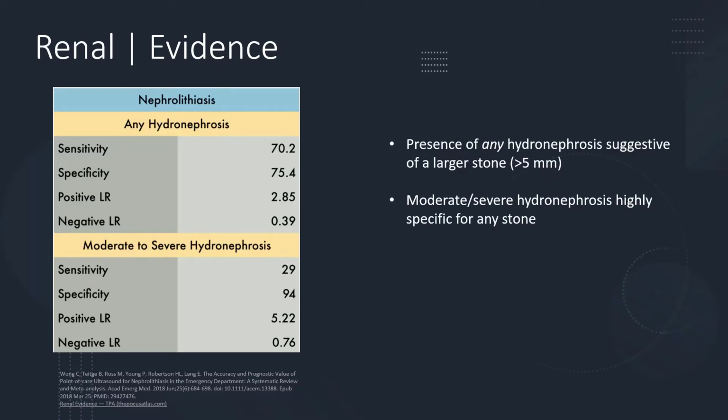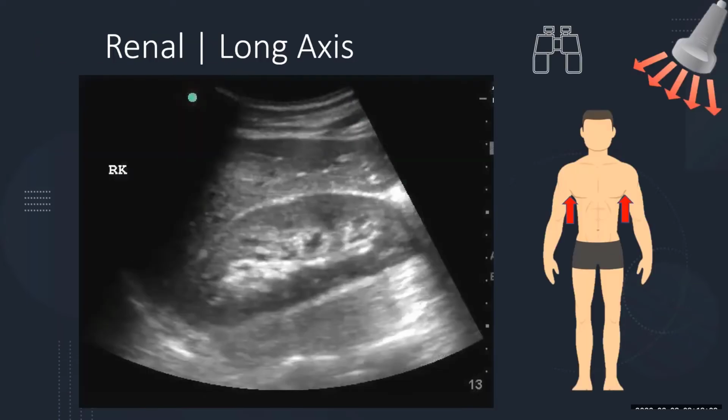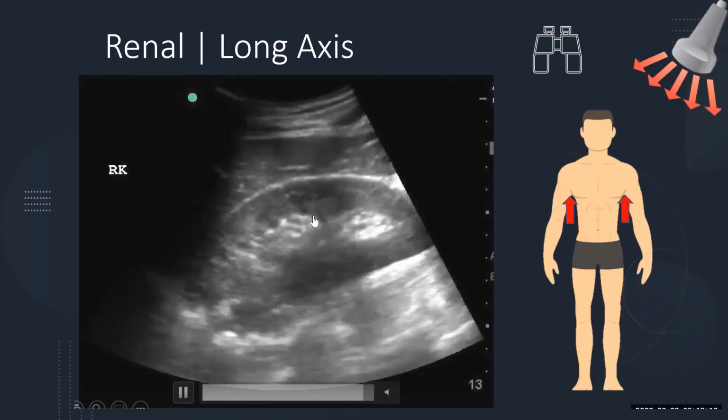And they also found that any hydronephrosis was suggestive of a usually larger stone greater than 5 millimeters. However, it's important to note that any stone can technically cause hydronephrosis. Doesn't necessarily matter how big it is. It can, depending on that. So moving on to the normal views.